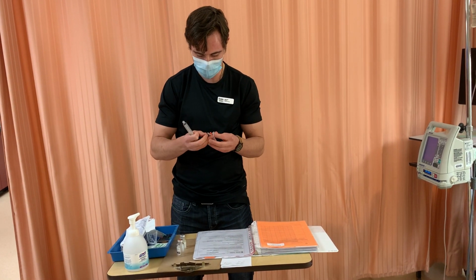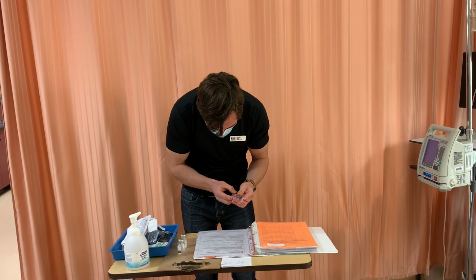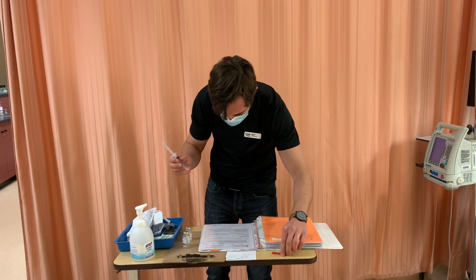I'm going to wing back the tips. I'm going to draw up here for this 1 gram vial. We're going to need to put in 20 ml of sterile water.